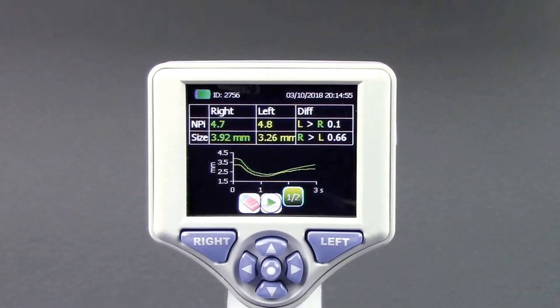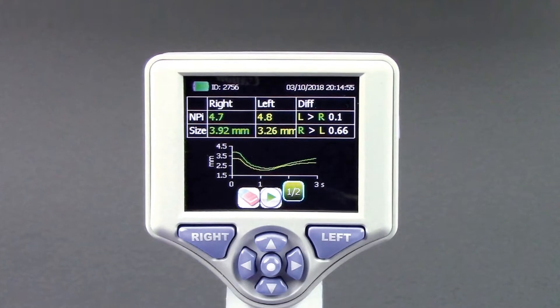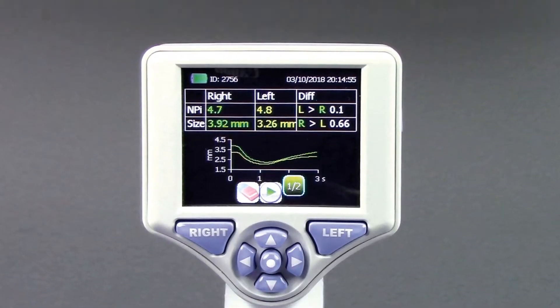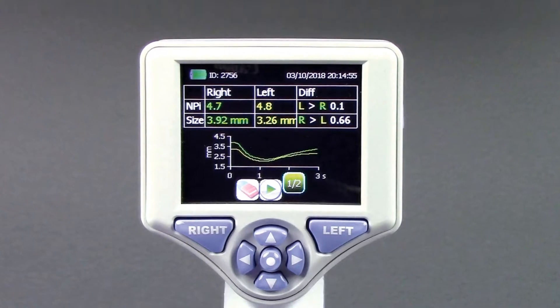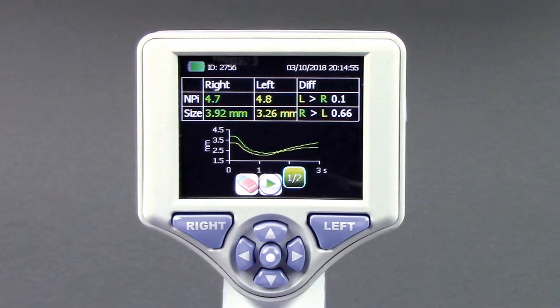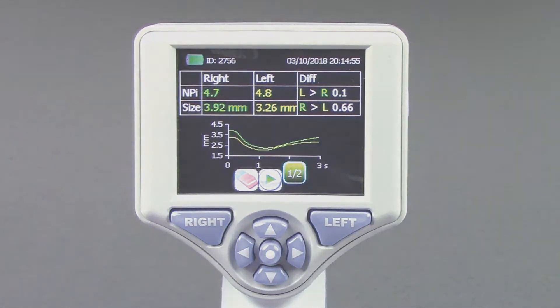Automated Pupilometry provides accurate, reliable, and objective pupil measurement independent of the examiner. By removing subjectivity from pupillary evaluation, the NPI 200 Pupilometer provides benefits to clinicians and patients through its ability to detect subtle pupil changes and to trend these changes over time.